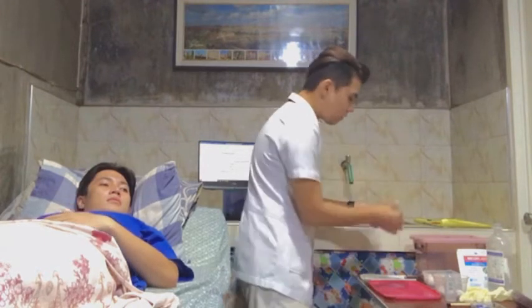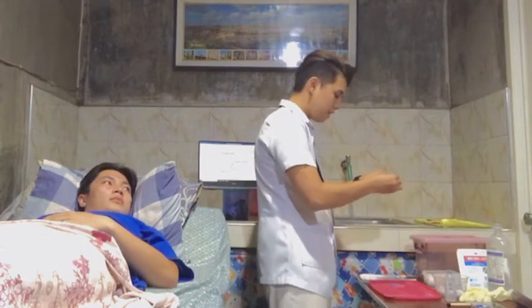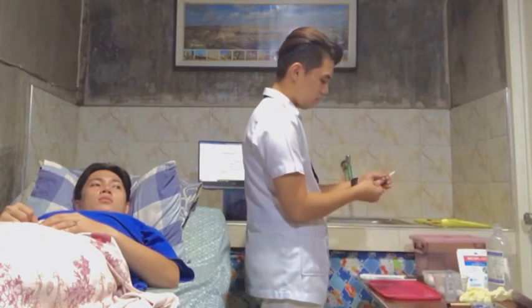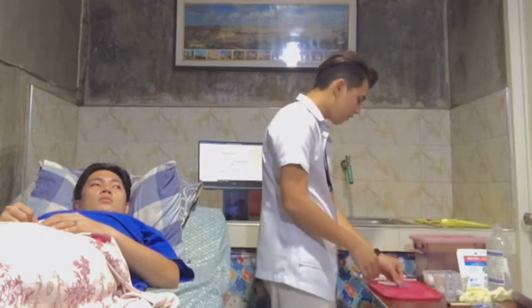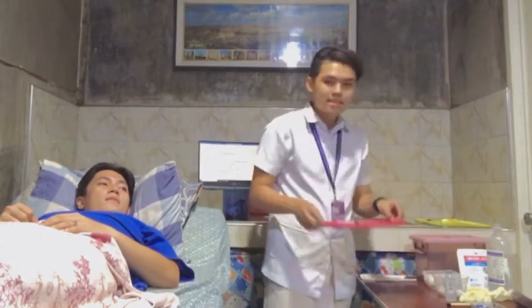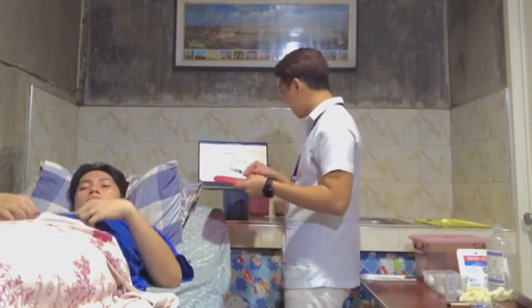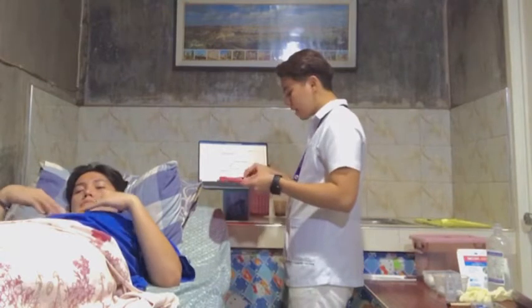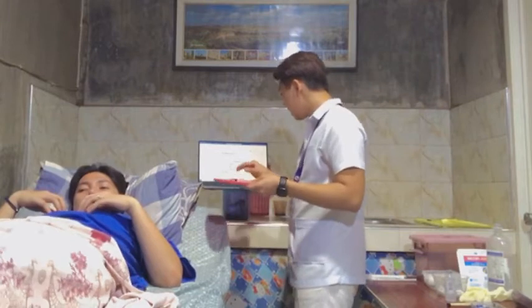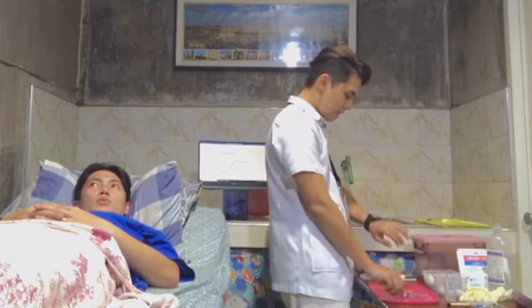Okay. So after that, transfer the aspirating needle to the needle gauge. So this is the needle gauge. And then, of course, bring this one with the medication ticket. So let us have our second safety check. The right medication is sodium chloride in ampule. The right dosage is 3 ml. And then the right route is intramuscular, and every 6 hours, 10 a.m. So as you can see, the room is 210, as I have checked earlier.